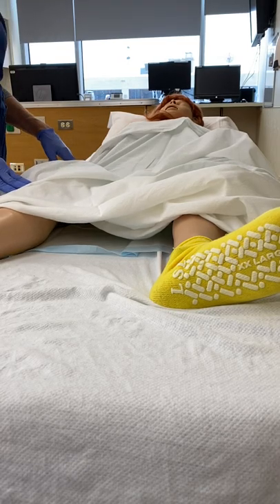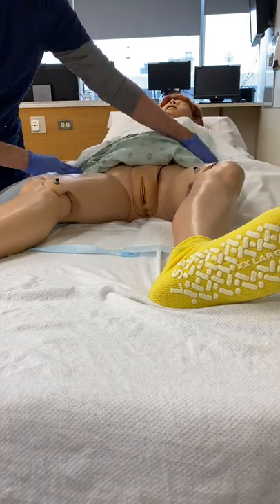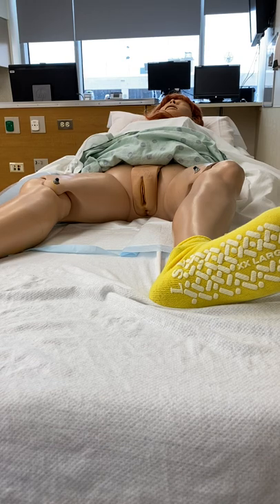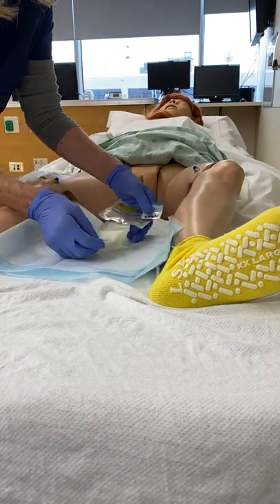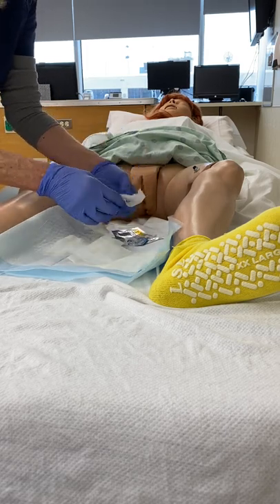Hi Lulu, I'm Catherine. I'm going to be placing your catheter. First I need to lift up your gown — I have the SureStep Foley System Tray. The first thing we do, there's a little packet with some cleaning supplies. I'm going to open up the Castile Soap Towelettes and place them out on there.